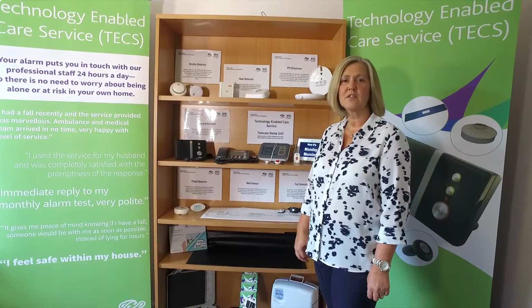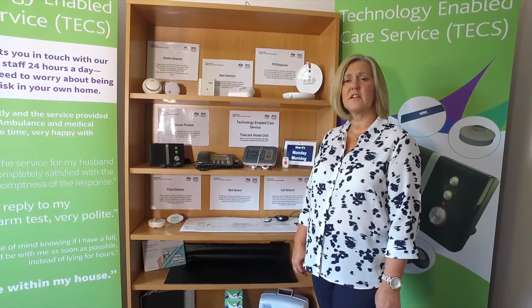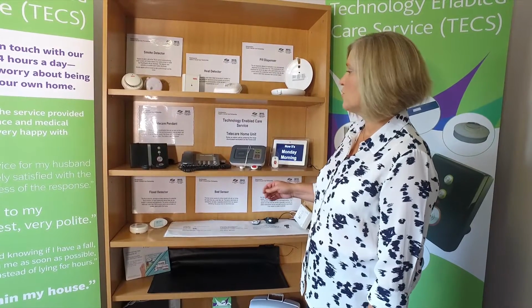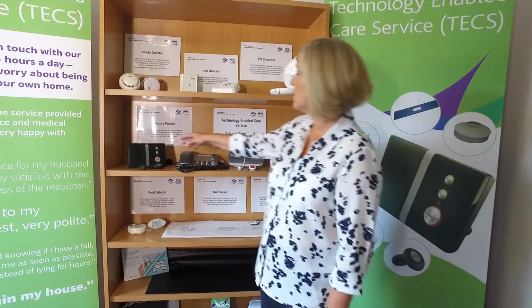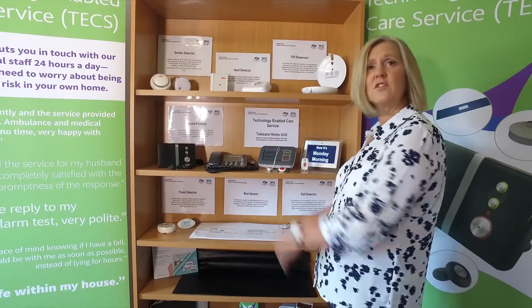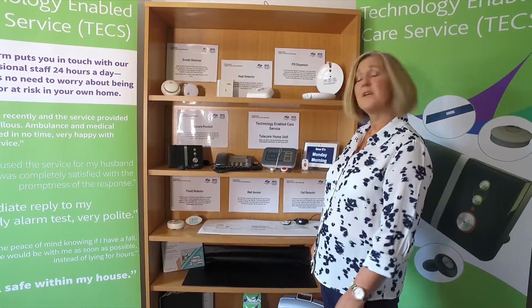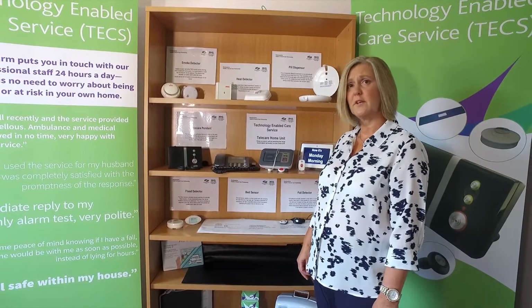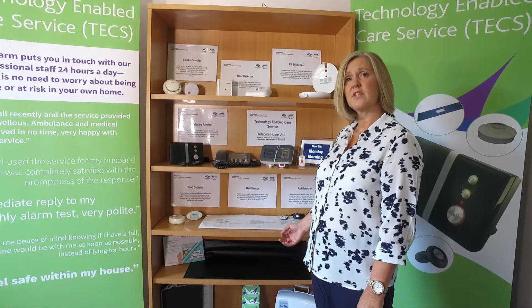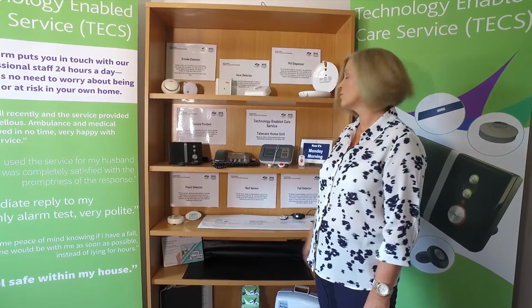Technology Enabled Care is made up of two components. There's a community alarm base unit and the enhanced telecare that sits surrounding that base unit. A few examples of the base units that are used within Renfrewshire are shown here and here. We use two different suppliers, so it varies on what your needs are as to what system you will actually receive. A basic community alarm uses your telephone line, so it connects into your telephone line with a power socket also that's plugged in to allow the battery within the community alarm unit to remain charged at all times.